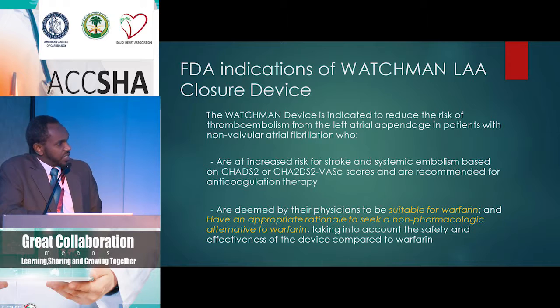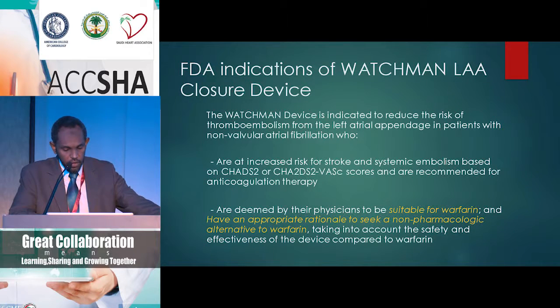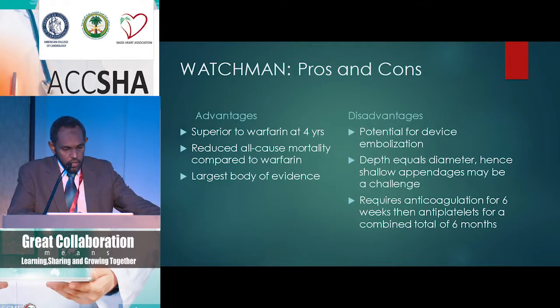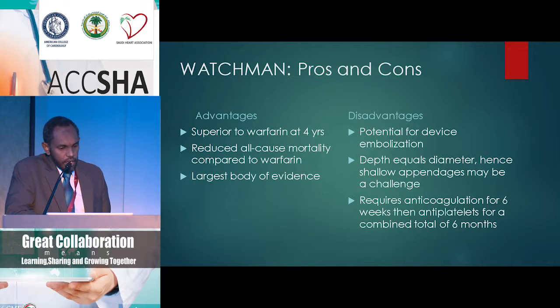So the WATCHMAN device is now indicated by the FDA for use in patients who have an indication or are suitable for warfarin use, but also should have an appropriate rationale to seek a non-pharmacologic alternative to warfarin. And this is just to justify the risk of the procedure. Now, advantages and disadvantages of the WATCHMAN device.